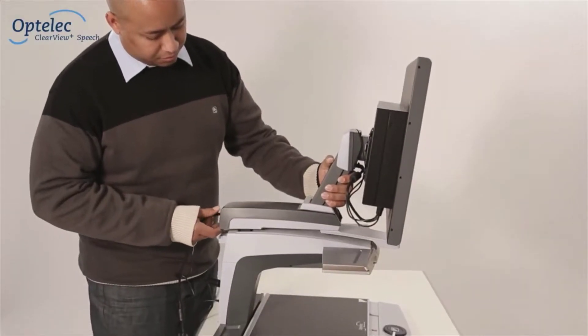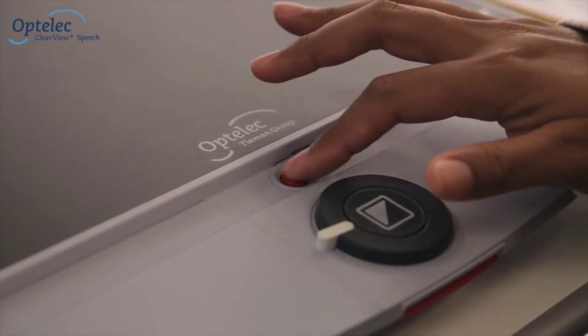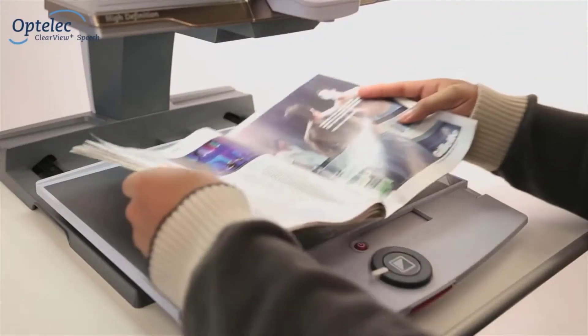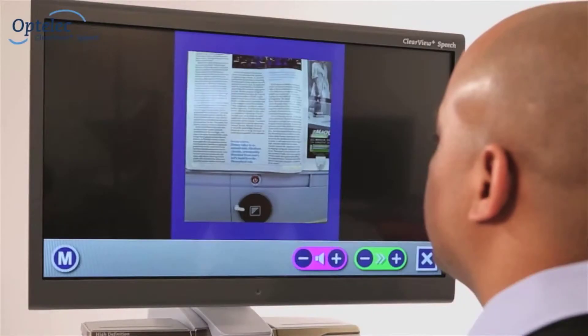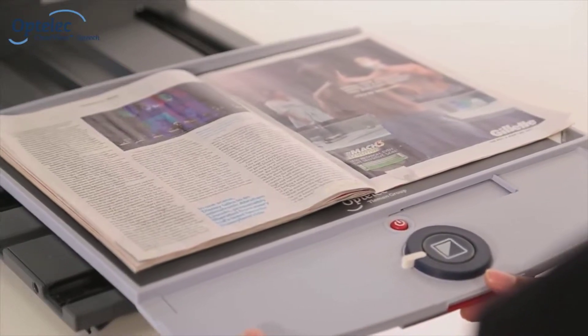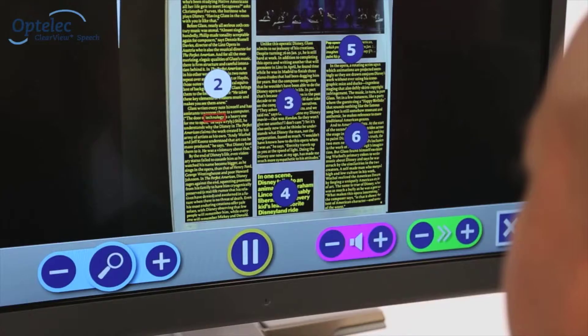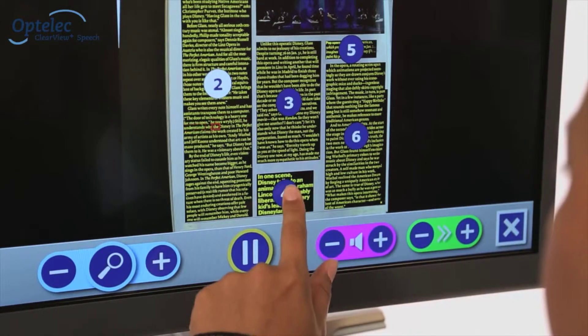Attach the module to a Clearview Plus desktop video magnifier and turn the Clearview Plus on. Tap the screen to activate the speech function. Position a document into the reading frame and tap the screen again. The Clearview Plus Speech will automatically start reading aloud and will mark each paragraph.